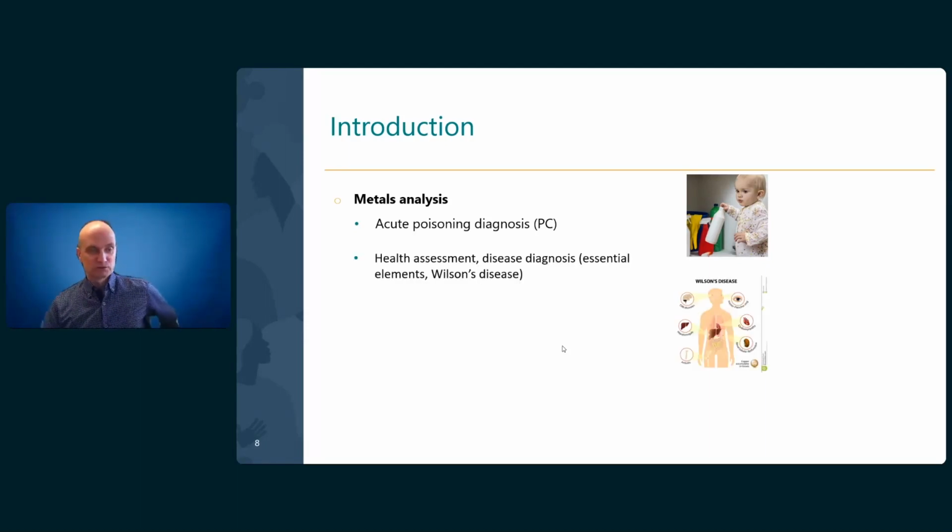But we also use this assay, this test, for health assessment, either related to disease diagnosis or not, especially when physicians want to assess the essential elements, or in some diagnosis like Wilson disease and other kinds. So it's very important to measure the metals in different, let's say, body fluids.